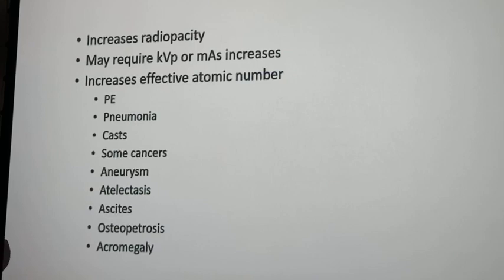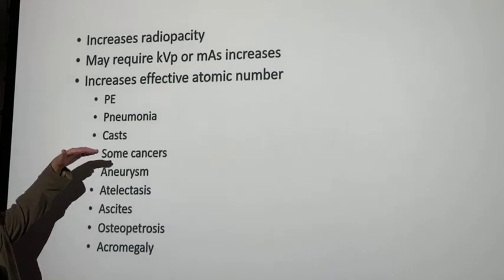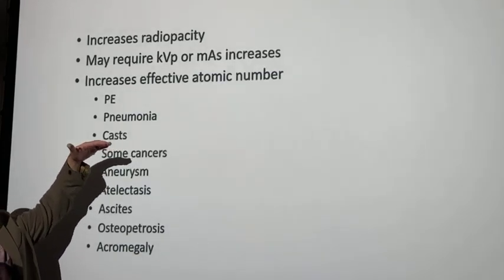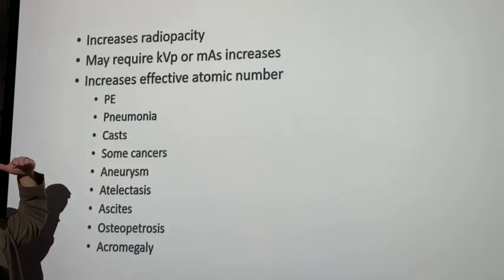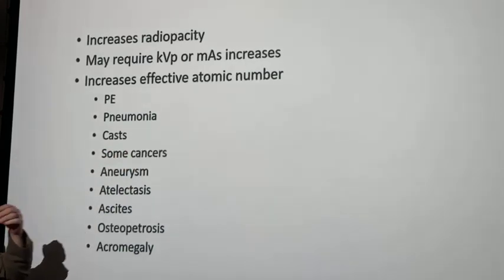Okay? So wet plaster, increase a lot. Plaster, increase still a lot, just not quite as much. Wet fiberglass, increase your technique a little bit.